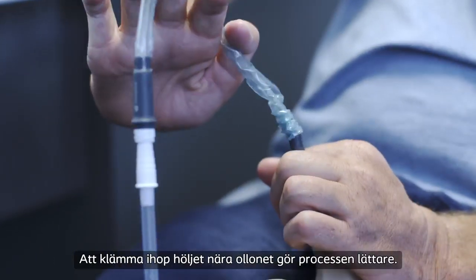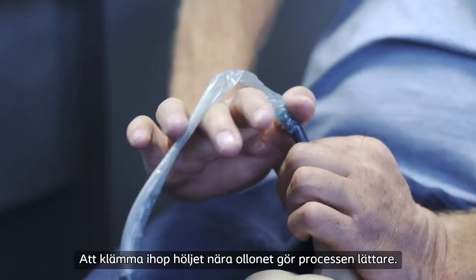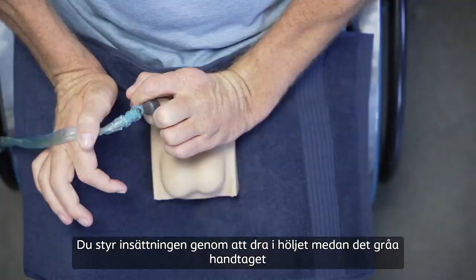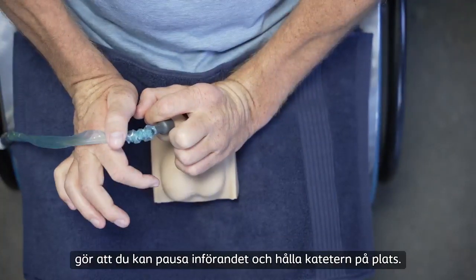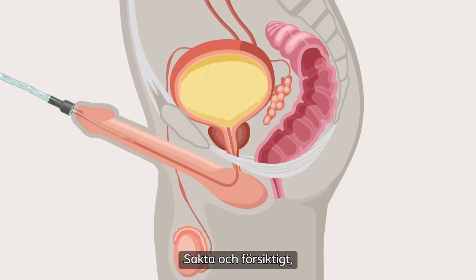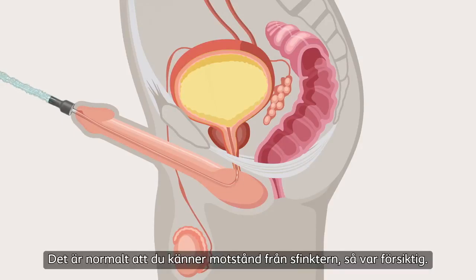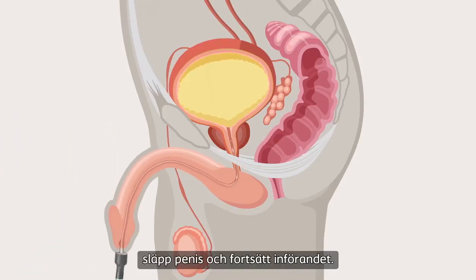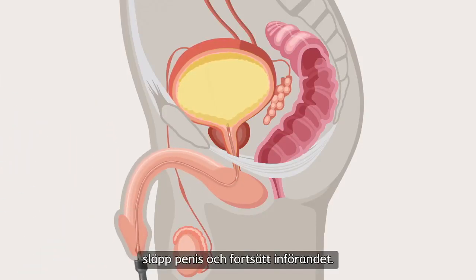Pinching the sleeve close to the head of the penis makes the process easier. You control the insertion by pulling the sleeve, while the grey handle allows you to pause insertion and hold the catheter in position. Slowly and gently insert the catheter into the urethra. It's normal that you feel resistance from the sphincter, so be gentle. When you're about halfway through, release the lift of your penis and continue the insertion.